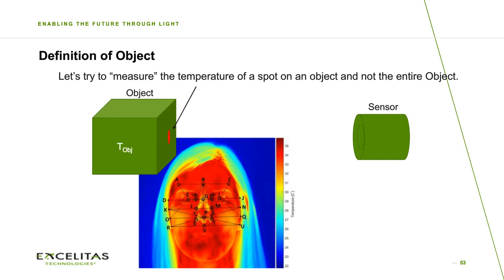However, please have a look and notice that they are always comparing the measurement to a reference black body in this distance of the person. So when the person is not at the same distance like the reference black body, then you might be very strongly affected by not only distance dependence, but also other effects like absorption in the air.